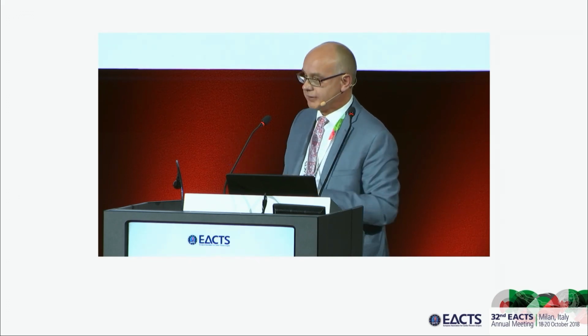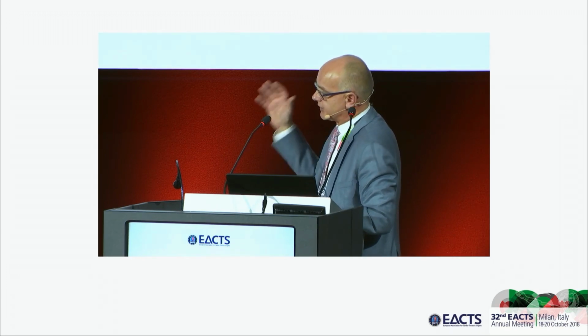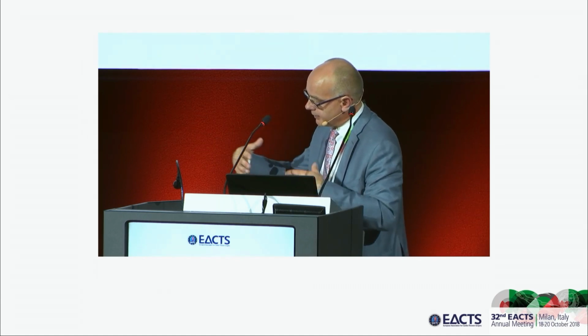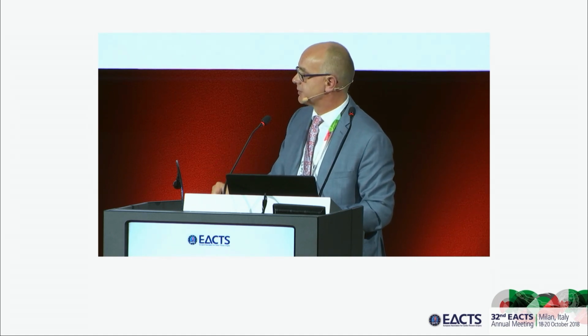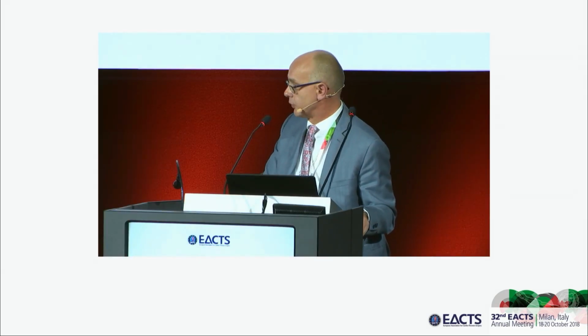And there is another, at least theoretical advantage of this expandable ring, because this expandable ring enables the movement of the aortic root at the level of the subcommissural triangle. And actually my group proved that this expandability is sustained in vivo. And do you see this expansibility in vivo for how long? Well, we did a CT study, 2 years follow-up. That's all we have. Okay, thank you.